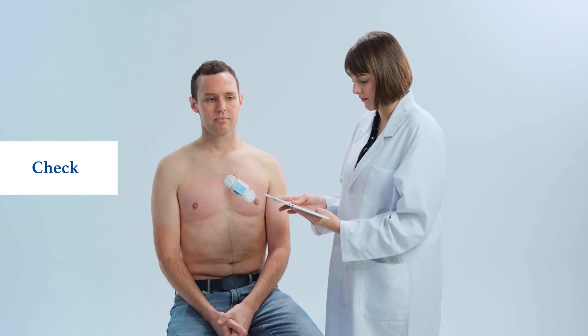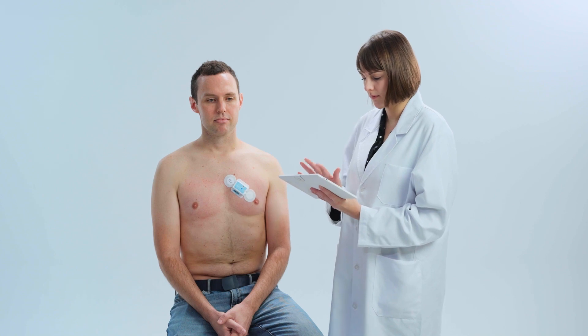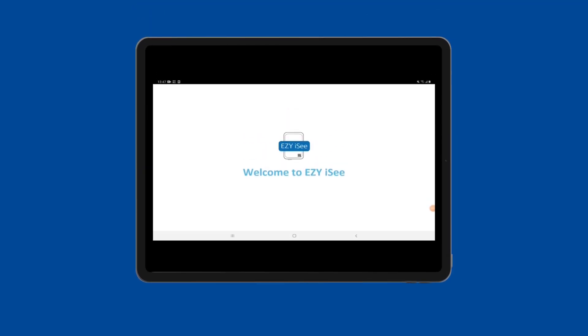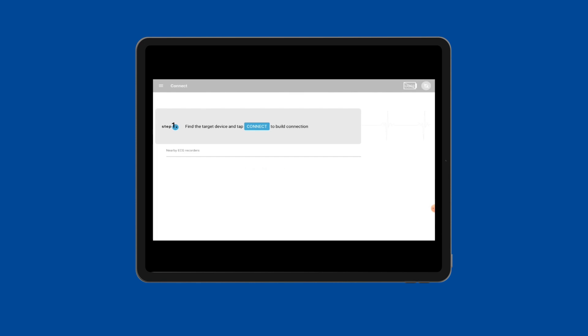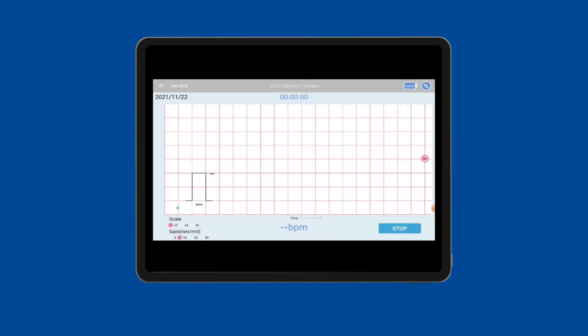EasyPro allows health professionals to immediately view live ECG feed using Bluetooth technology. Download the EasyIC app on any device with a Bluetooth connection. Enter the app, find your device serial number, and start pairing. You can see the ECG transmitting clearly on the screen. Making sure the strip is cleanly adhered in the beginning helps the device stay in good contact while recording.